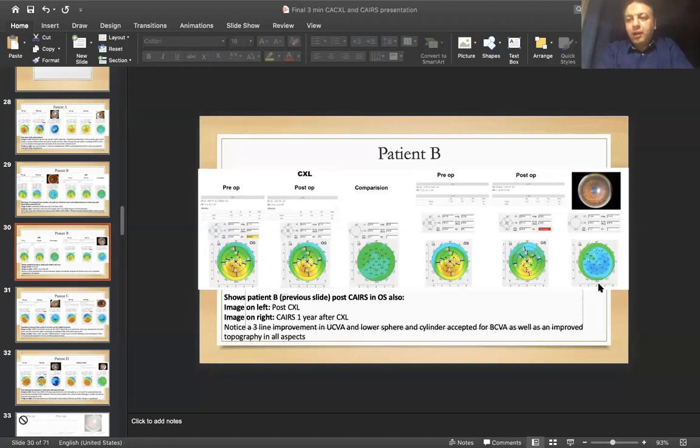Okay. So the aim of putting something inside the cornea is the regularization of this cornea, not only stretching of this cornea. Am I right? Yeah, as I said, yeah.